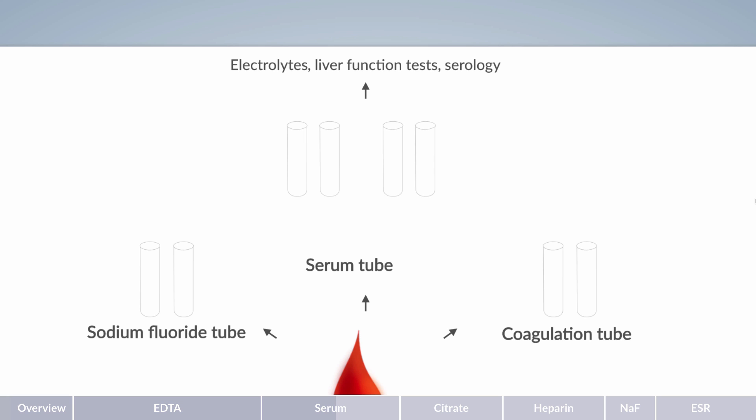Serum tubes are characterized by a red cap according to the international standard and a white cap according to the European standard. These tubes don't contain a serum gel separator. However, there are also tubes that contain a serum gel separator. These have a yellow cap according to the international standard and a brown cap according to the European standard.